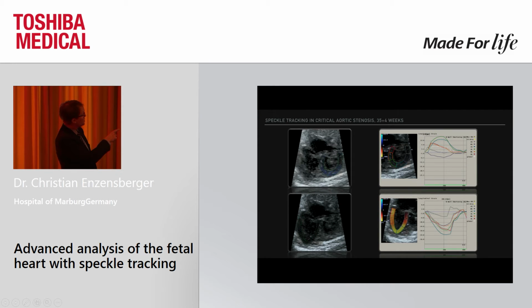As you can see here, the graph shows a positive longitudinal strain during the systole, which is completely different to the normal way we are expecting in a healthy fetus.